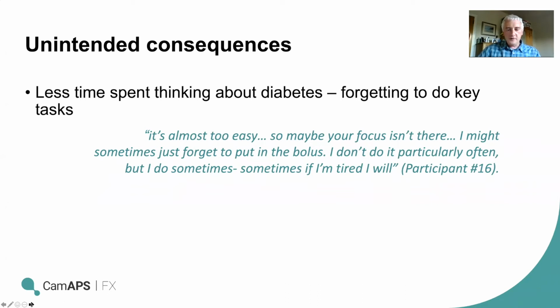However, as a few pointed out, thinking less about diabetes could also result in them forgetting to carry out some key diabetes tasks, such as bolusing for a meal. So it's almost too easy. So maybe your focus isn't there, this participant said. I might sometimes just forget to put in the bolus. I don't do it particularly often, but I do it sometimes. Sometimes if I'm tired, I will.